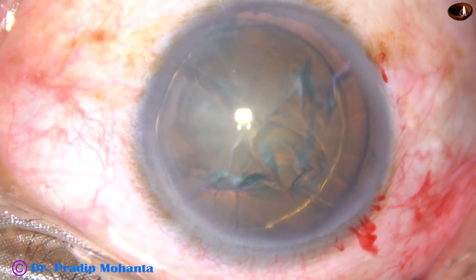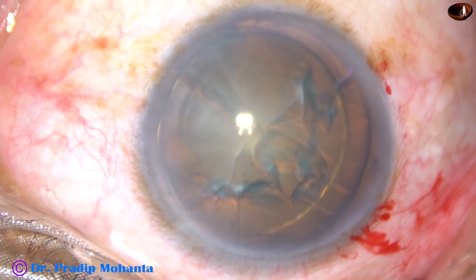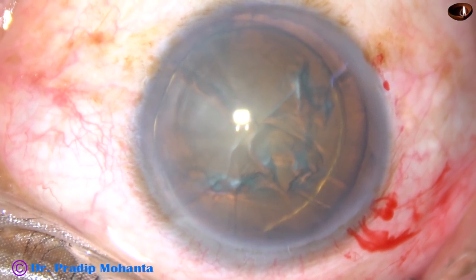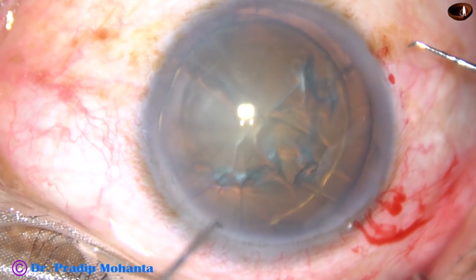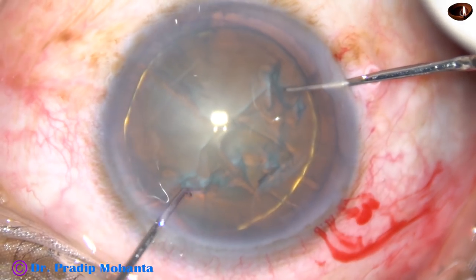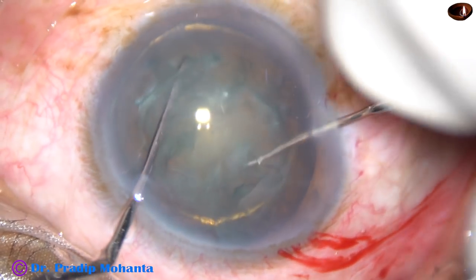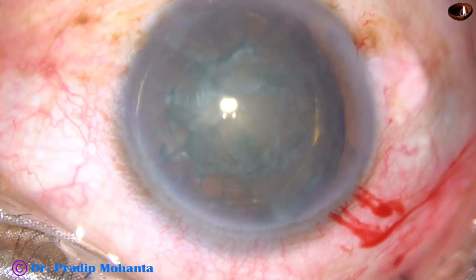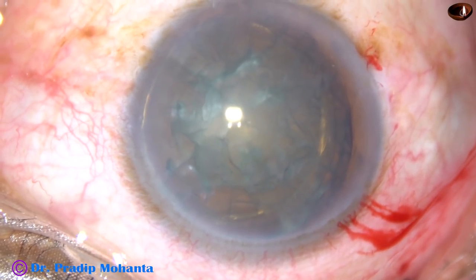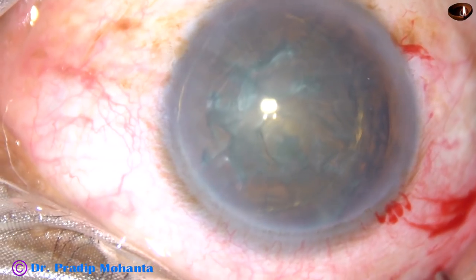And now, how to rotate the nucleus? There are many ways. Beginners can rotate the nucleus with two instruments — take two Sinskey hooks, or one chopper and one Sinskey hook, and place them like this. The right instrument pushes the nucleus towards 6 o'clock and the left instrument pulls the nucleus towards 12 o'clock. And thus you can rotate the nucleus very comfortably.